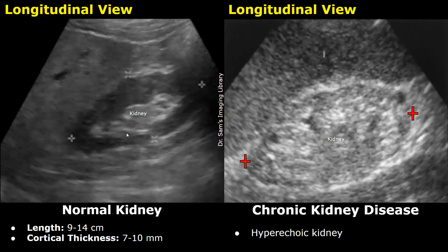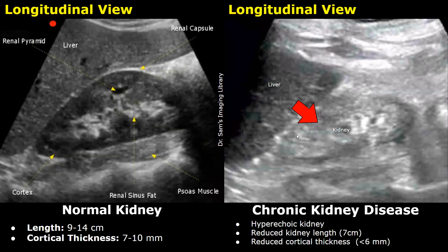In chronic kidney disease, the kidney will appear hyperechoic — we see a very bright hyperechoic kidney. The hyperechoic kidney also has a reduced length; it will appear smaller than normal, and the cortical thickness will be less than 6 millimeters.